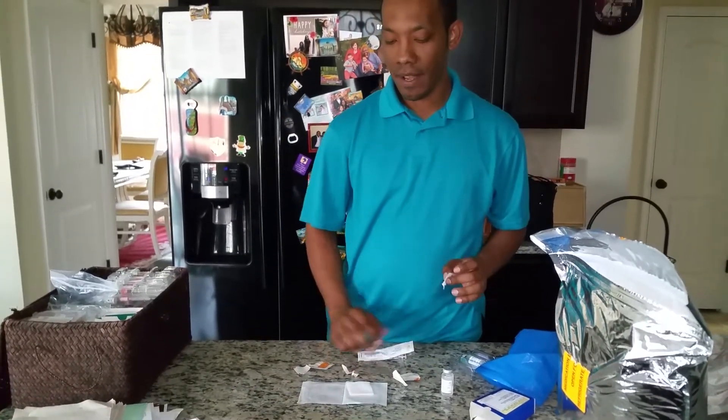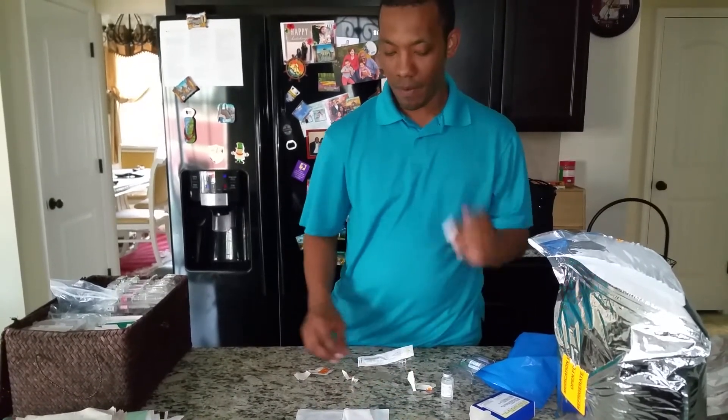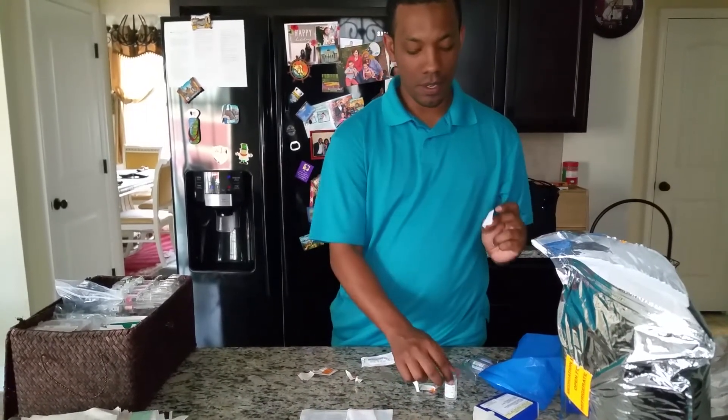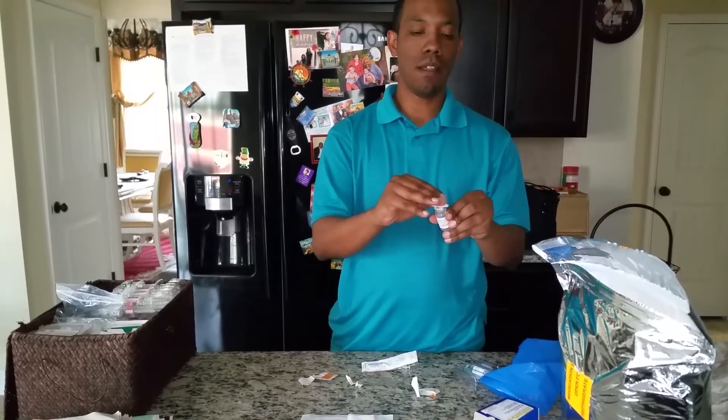Not ready, but ready to be prepared. We have gauze, one alcohol wipe for the body, one for the Lupron vial lid. First, I'm going to clean off the Lupron vial lid.